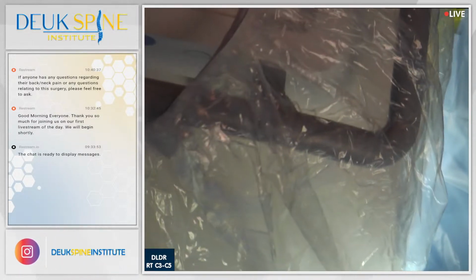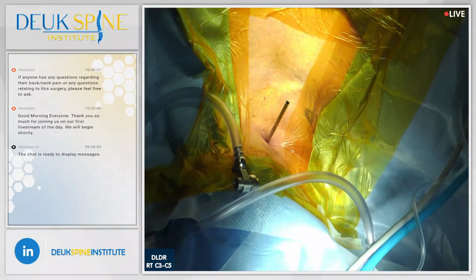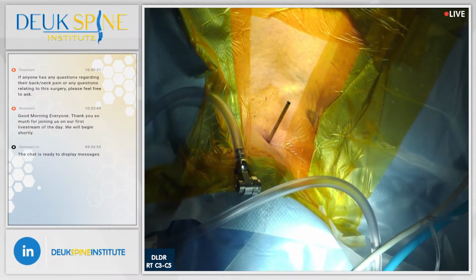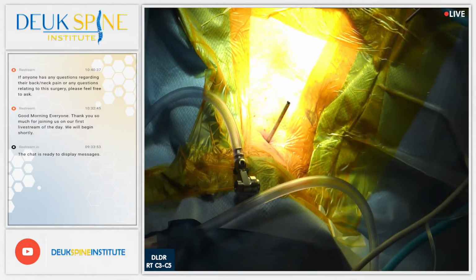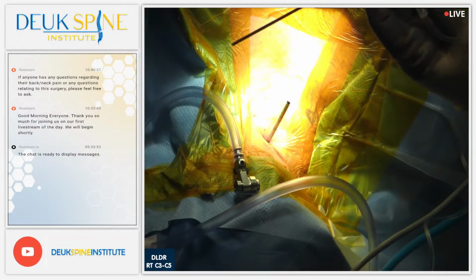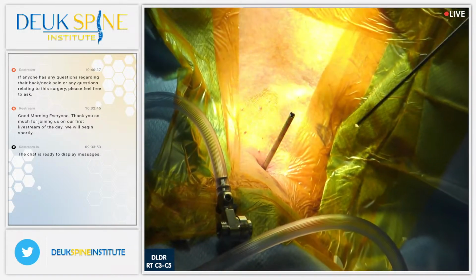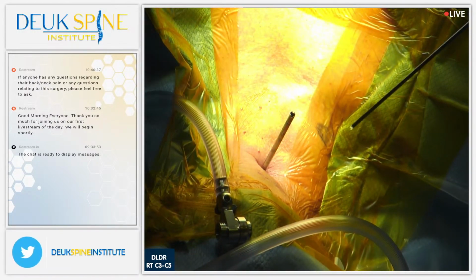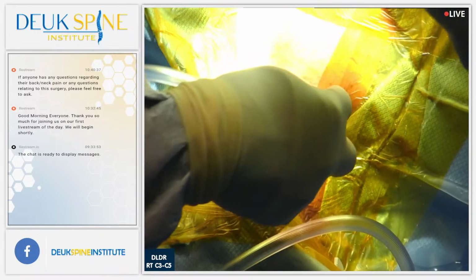Any questions? At this moment, no current questions. Let's show our audience how the Deuk laser disc repair works in the neck to clean up the tear, remove the herniation as much as possible, all without putting metal, all without hospitalization, all without major open surgery. All done minimally invasive. I got it. Copy that.